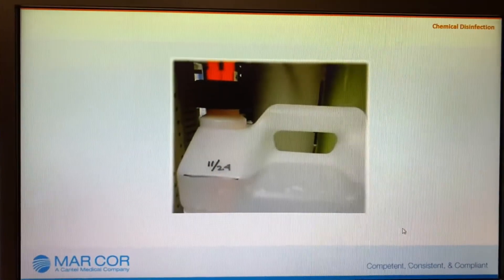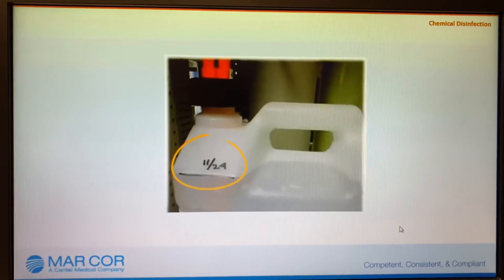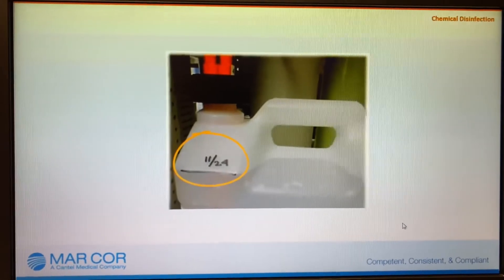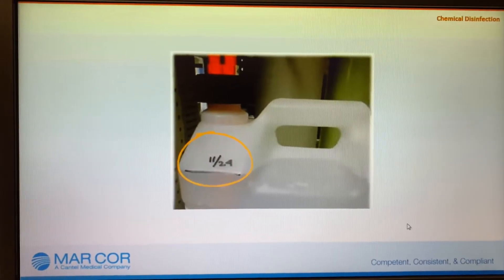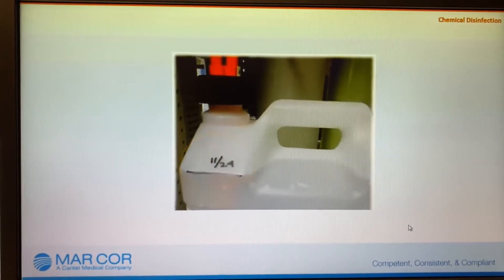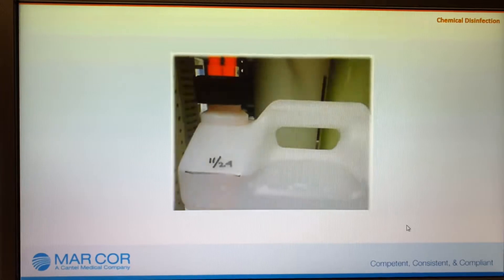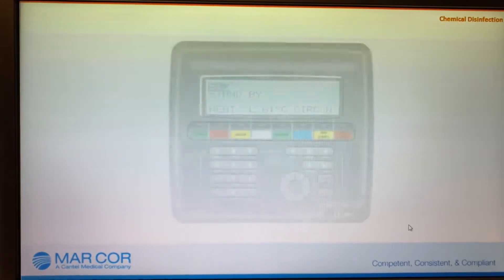Check the level and date recorded on the disinfectant container. If the level doesn't change, the chemical intake may have failed.